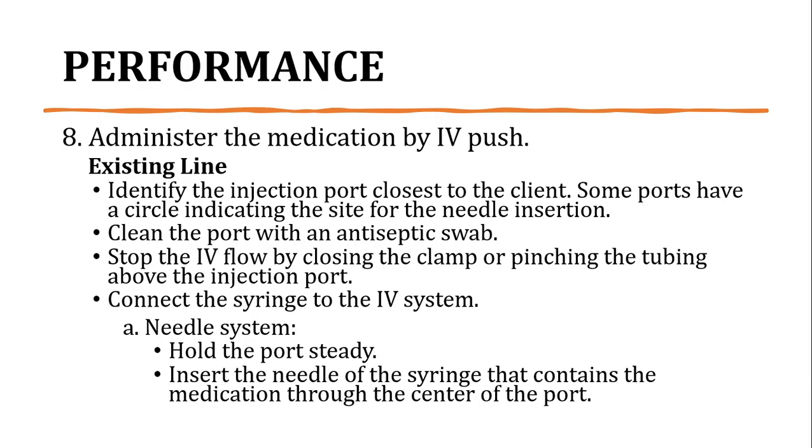And kailangan po sa medication port, hindi sa IV tubing because po kapag doon po nilagay yung syringe, after the administration of the medication kapag tinanggal na yung syringe niya is mayroon nang butas doon sa IV tubing, mag-leak na yung fluid doon sa tube na yun. Yun po, kailangan po talaga sa injection port na close sa client.